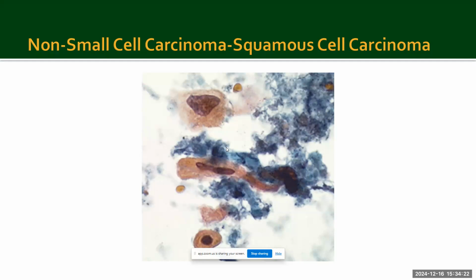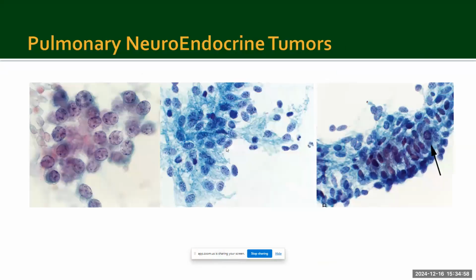Again, if you have lesional material available in the cell block, you can do immunostains. Squamous cell carcinomas are positive for P40. I usually try to save a lot of the cell block sample for the potential molecular analysis, and I do a very small immunohistochemical panel if at all necessary, especially in the limited cytology samples, and it is usually limited to TTF1, P40, and CK7. I do theranostic markers like PDL1 and HER2. That is our institutional protocol as well. We reflex PDL1 and HER2 in each of our malignant diagnoses.